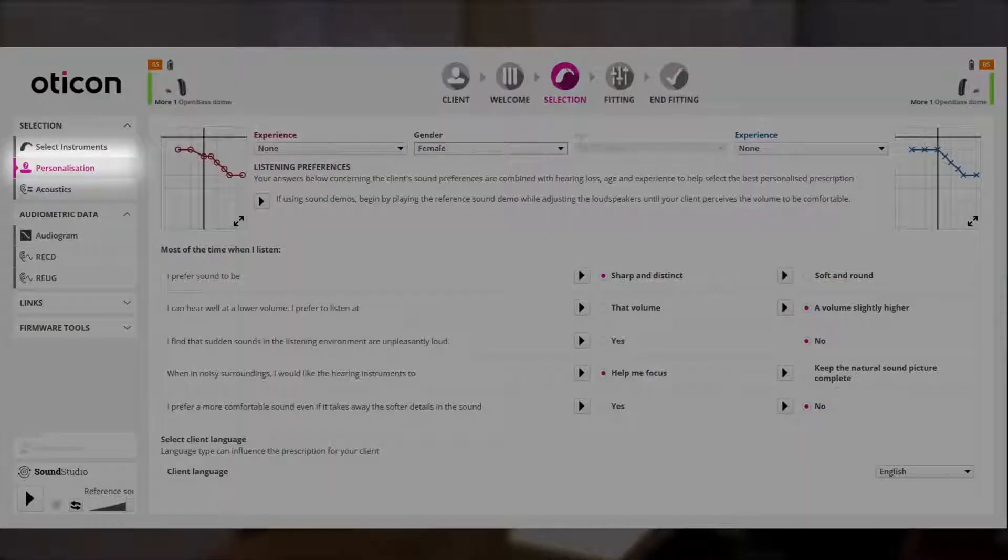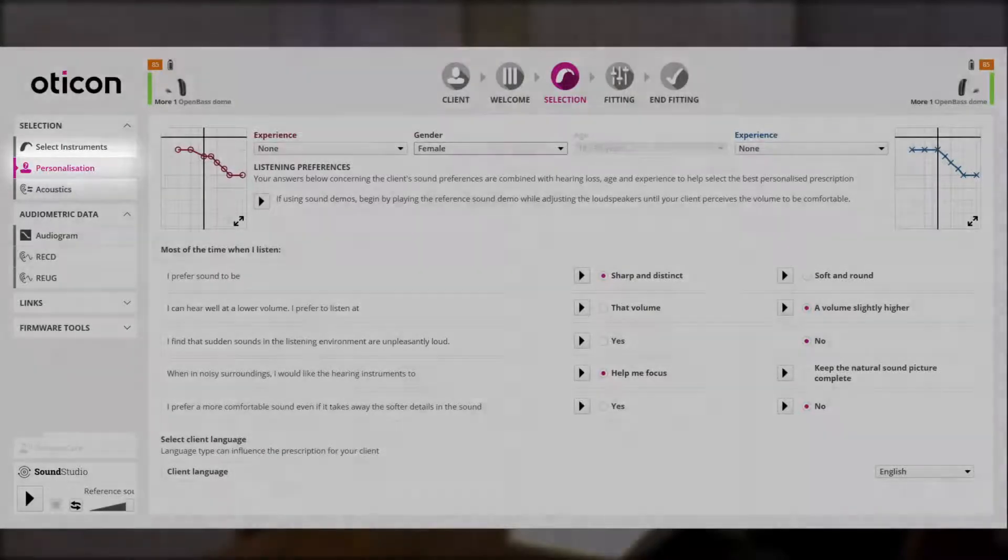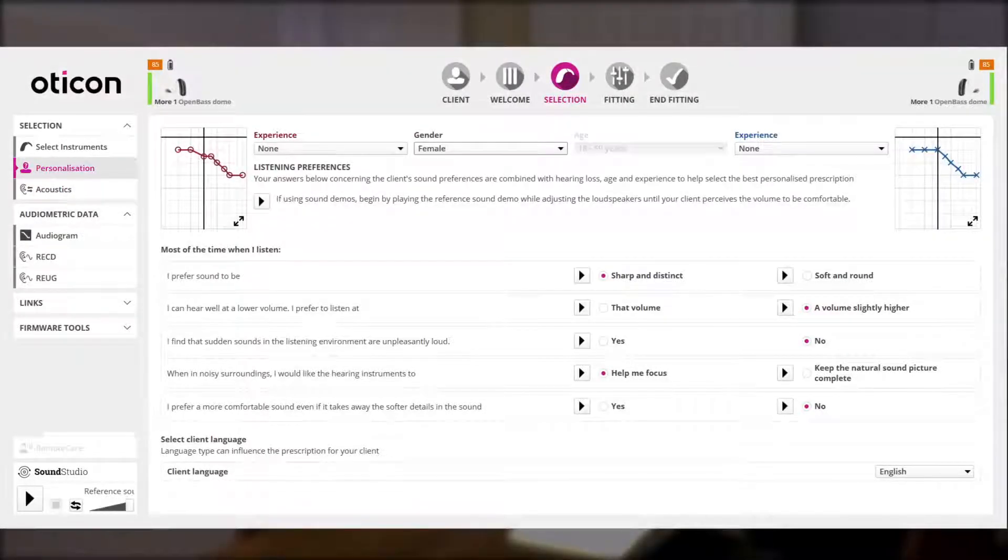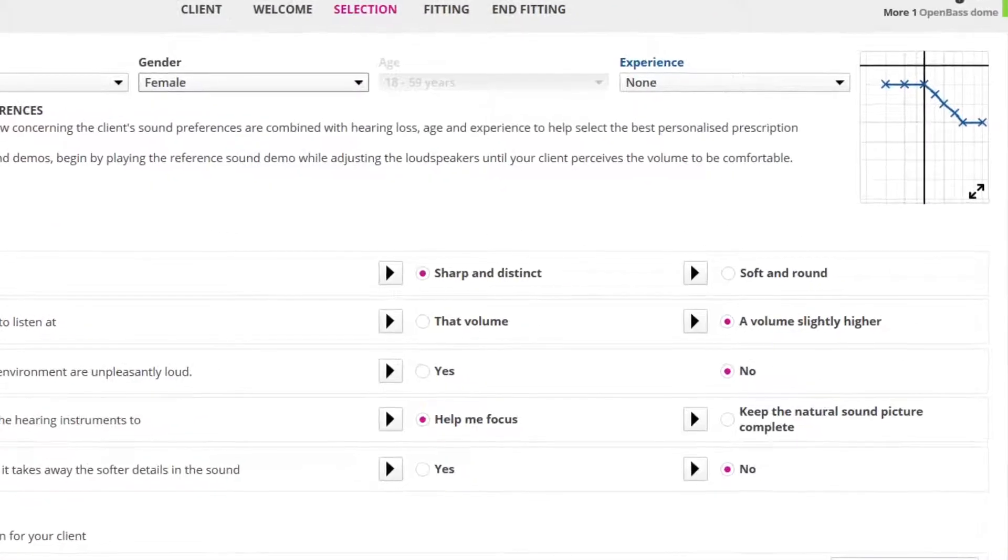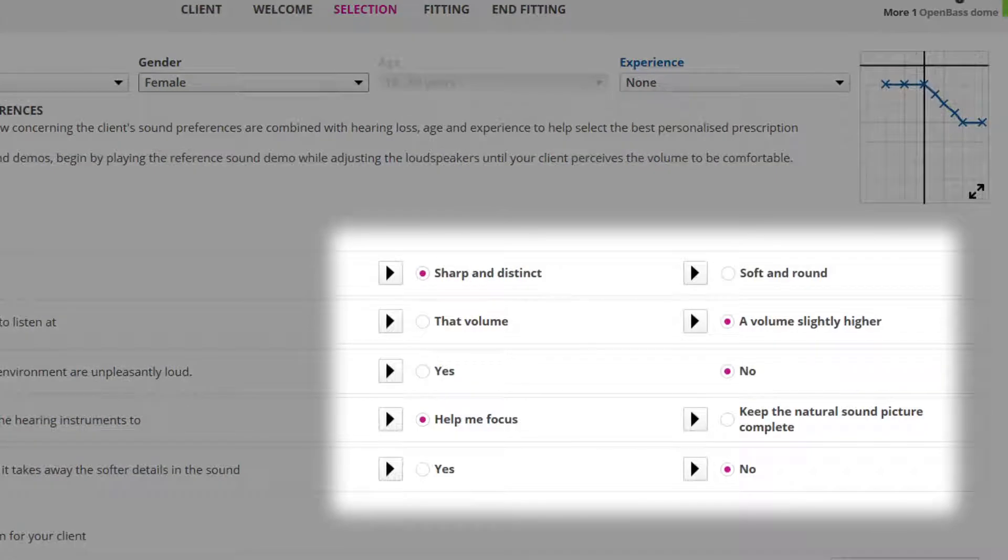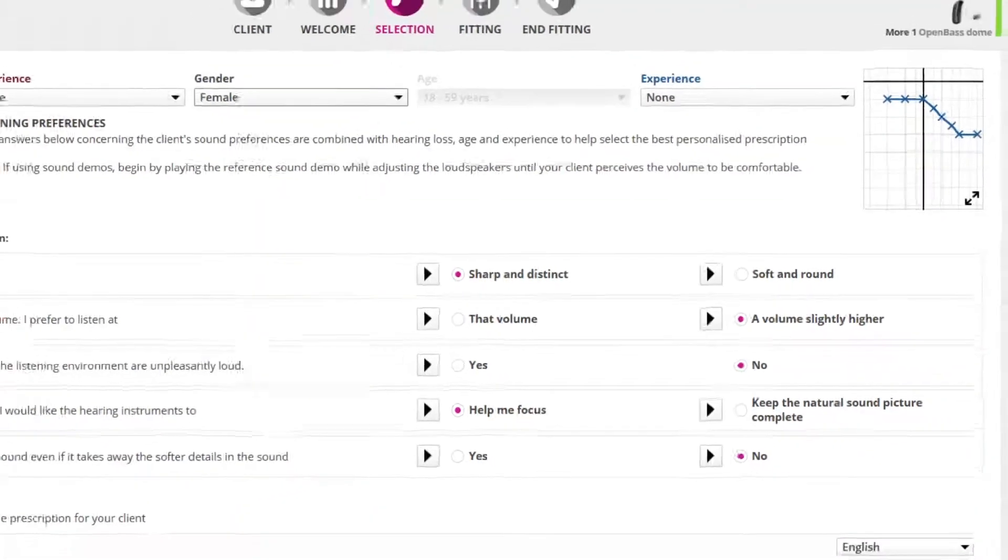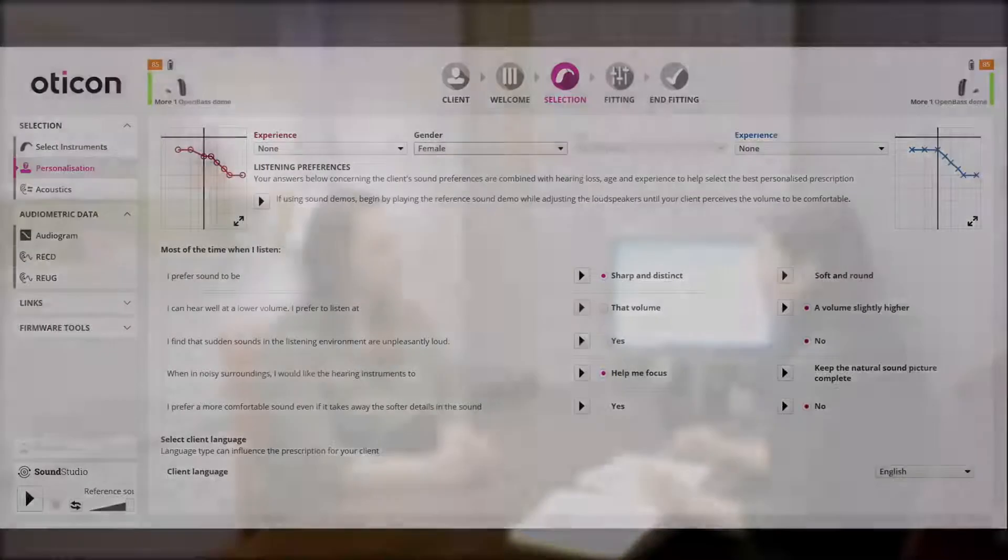Personalization allows users to take an active role in the integral part of the fitting process. It not only customizes the settings according to individual preferences but has been shown to also improve user satisfaction and adherence to rehabilitation. For best practice and results, Oticon recommends hearing care professionals use sound demos through loudspeakers using the little arrows for each one. The results of the personalization will be reflected in the More Sound Intelligence settings.